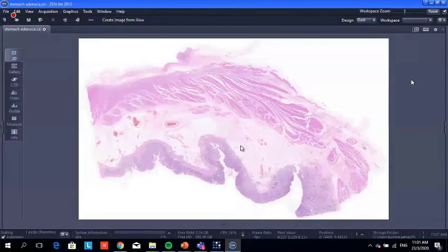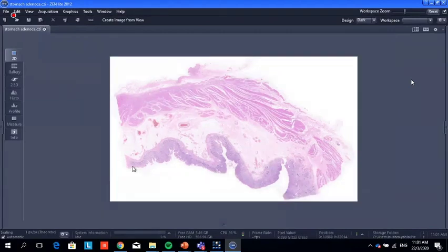Okay, what do you think the abnormality is? This area or this area? The right one. This one. Yes. Okay. Wait, first we go to this area.